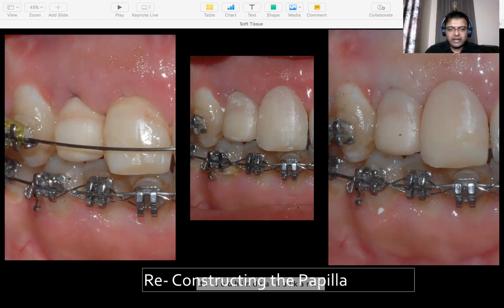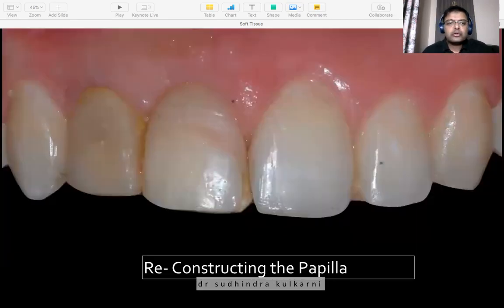What we did here was we had 2 implants, ideally placed. The inter-implant space, ideally, is 3 millimeters. In this case, we put 4 millimeters. The inter-implant distance was 4 millimeters. Temporized. So this is day one, this is probably around a week after temporization, this around a month. And then slowly you use the temporary to sculpt the tissue.